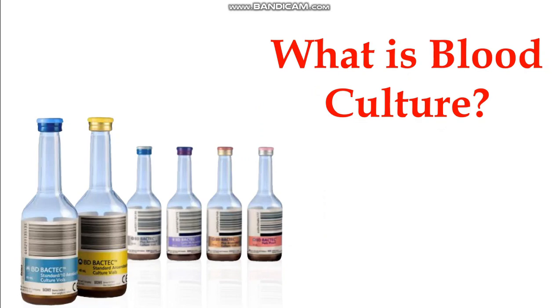Why is this so critical? Because a blood culture not only helps us confirm that there is an infection, but it also tells us what's causing it. And this is the key for selecting the right treatment, and without it, we are essentially just guessing.